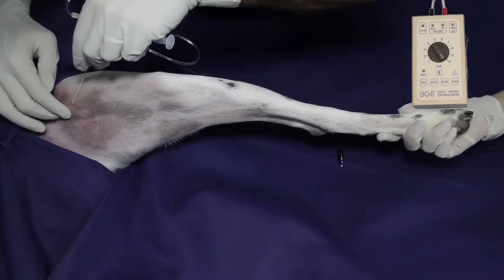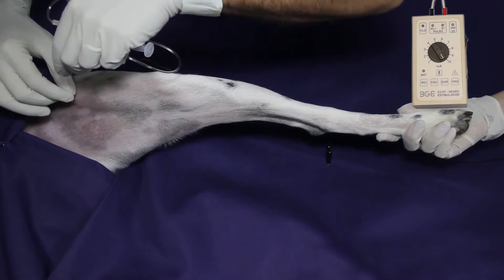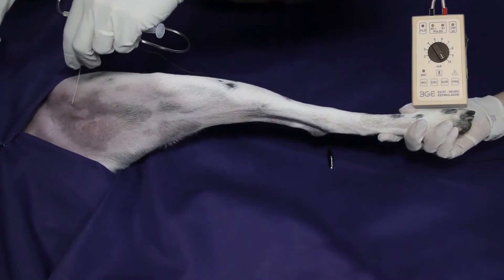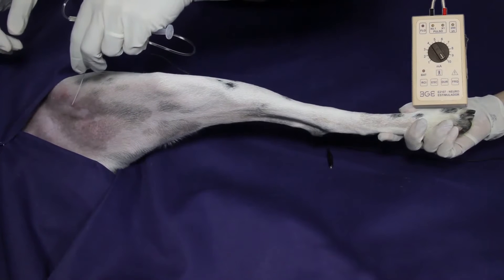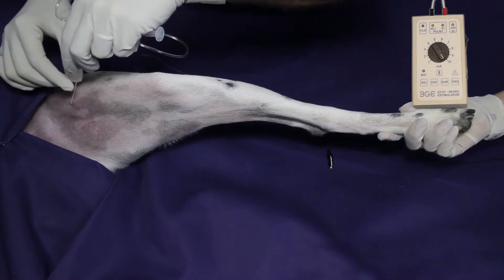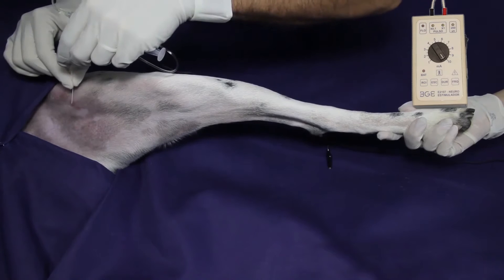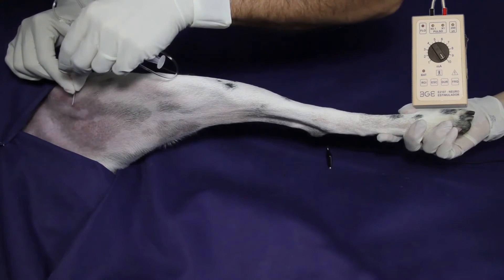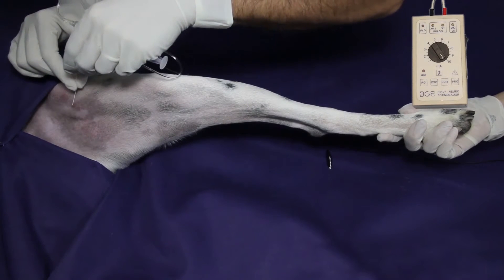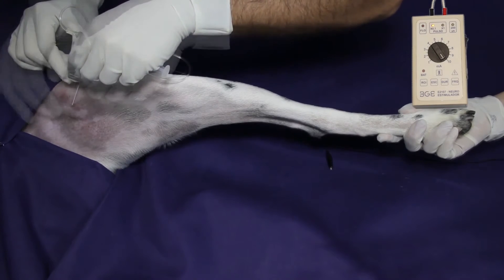Under aseptic conditions, a 22 gauge insulated needle is introduced superficially within the femoral triangle and just cranial to the femoral artery. The needle is slowly advanced towards the iliopsoas muscle while the nerve stimulator is set to deliver an electric current of 1 milliamp.